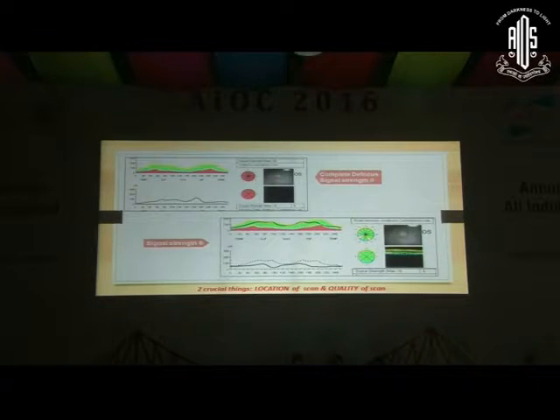What is also important is the quality of the scan. So you may feel that the scan on the top half is a very poor RNFL thinning map, but actually the scan hasn't been done correctly. And when it was repeated, you find that once you have the RNFL measured properly, the RNFL thickness is absolutely fine.